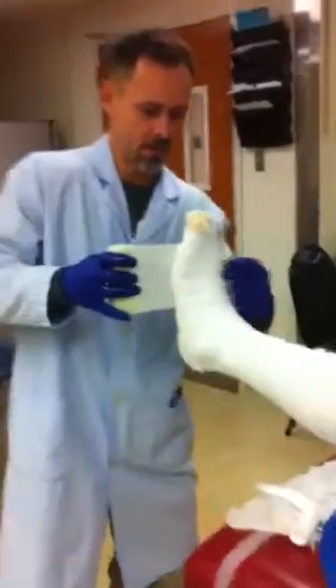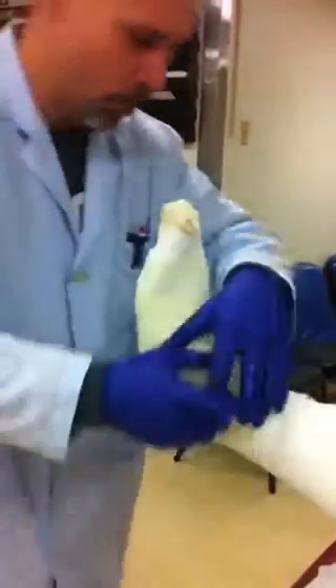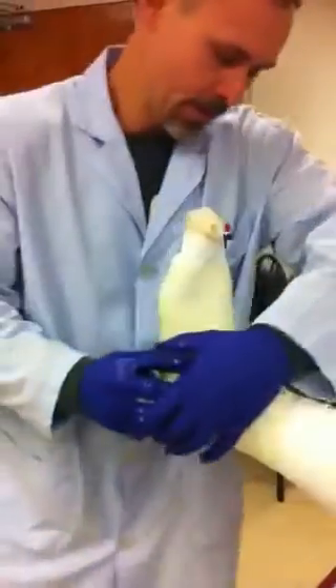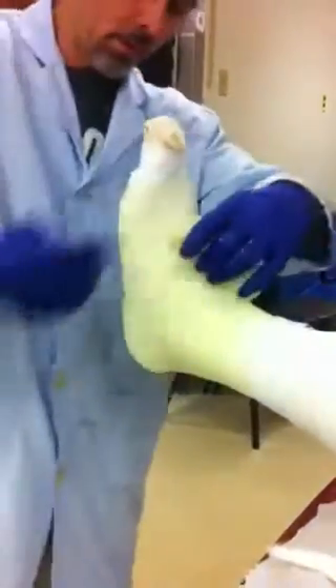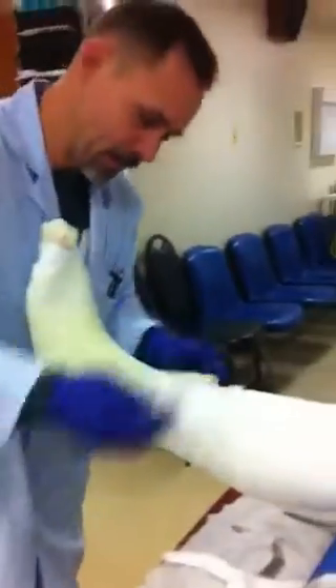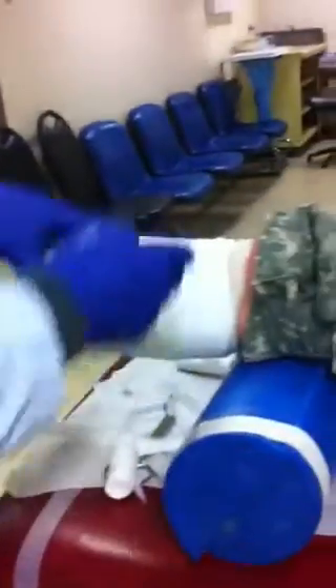So here we go with the actual cast material. This is fiberglass — it's like a gauze bandage, only with fiberglass in it. This is not something we can pull tightly, because when it gets hard it will constrict, so we have to be very, very careful. Once I break the seal on the wrapper, I only have about two minutes to wrap each roll, or else it will get too hard.